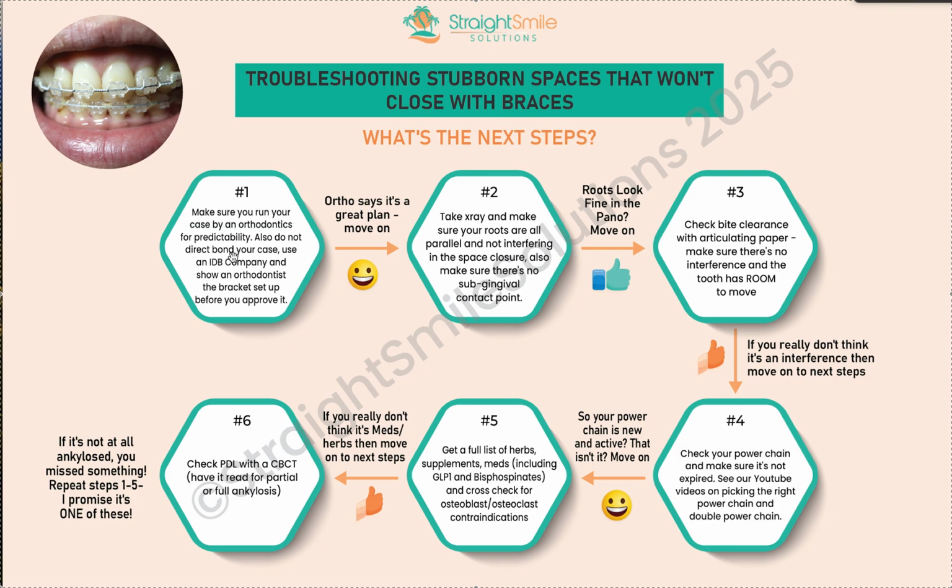So number one, make sure you run your case by an orthodontist first. Run it by them and make sure, if you can, it's better if you do indirect bonding over direct bonding to make sure the brackets are put on right. You have an orthodontist double check your case before you approve it. I always say that because if the case is wonky or not quite done right, well then, yeah, no, your spaces aren't going to close. So if it wasn't done right or if you put the braces on the wrong way and stuff.